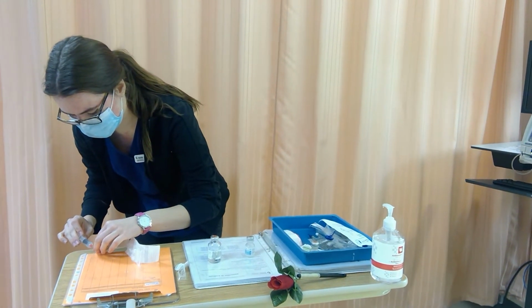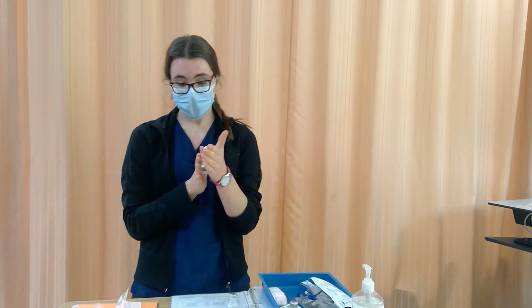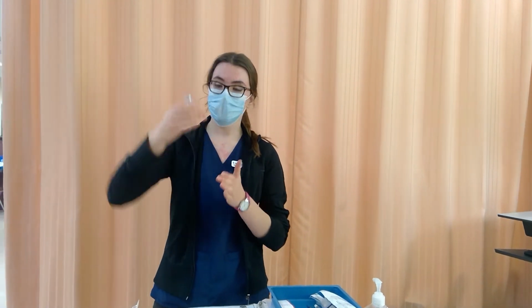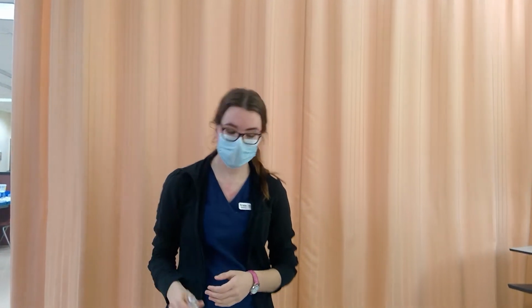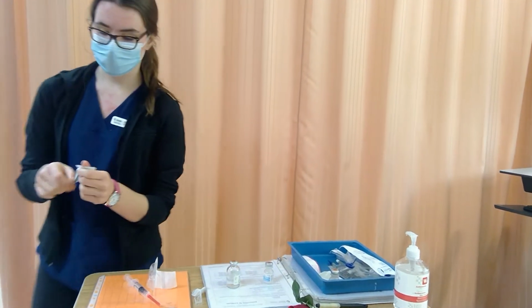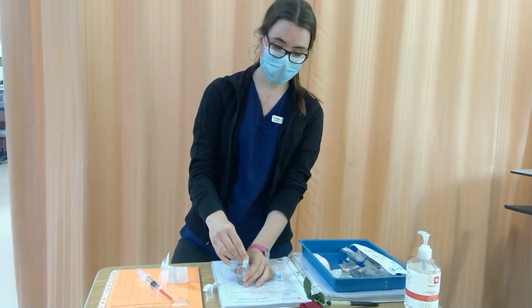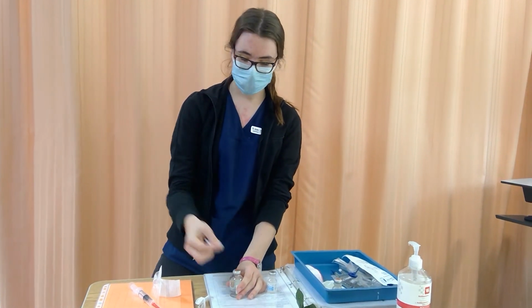Just going to recap utilizing the scoop method again. Great. I'm going to gently roll this, not too fast, to make sure that it's nicely reconstituted. I see there's no sediment at the bottom, so now I'm going to alcohol swab again because aseptic technique is just vital here. I'm going to be cleaning for 30 seconds and then drying for 15.